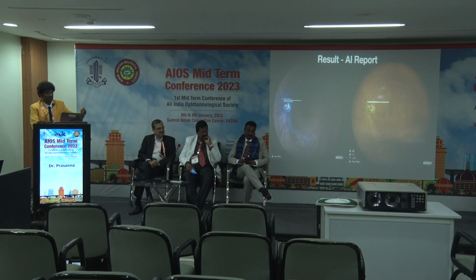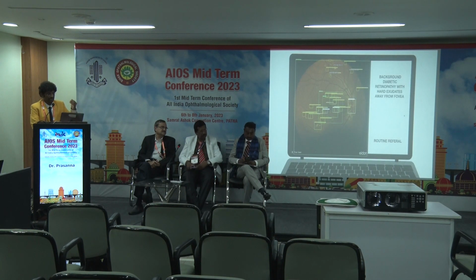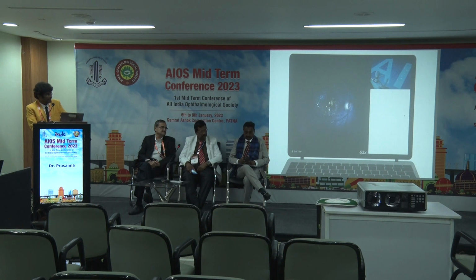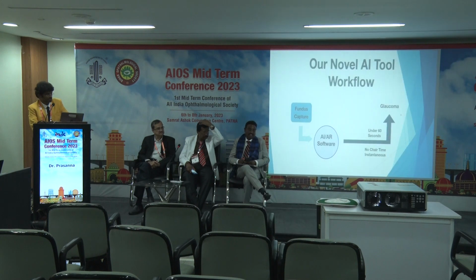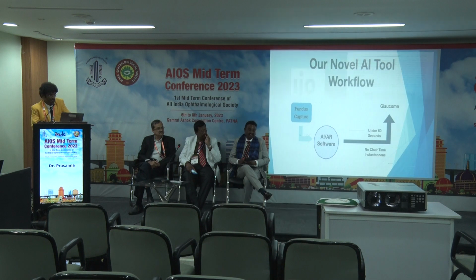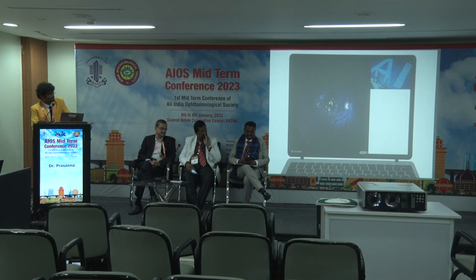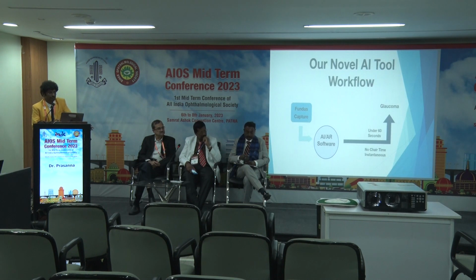Rather than just giving the machine the whole power, we make sure there are two human interfaces, of annotation and prediction, so that you can see an image of diabetic retinopathy like this is not only diagnosed as diabetic retinopathy, but is also annotated at multiple levels. You can see in this figure here, not only is the image annotated as diabetic retinopathy, but every part of the diabetic retinopathy fundus is predicted by the machine, to prevent the black box.